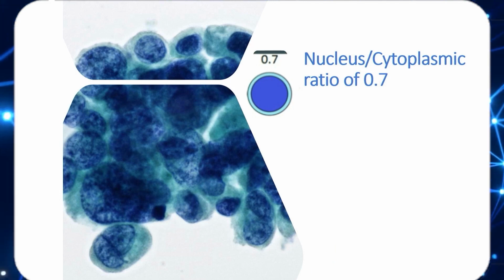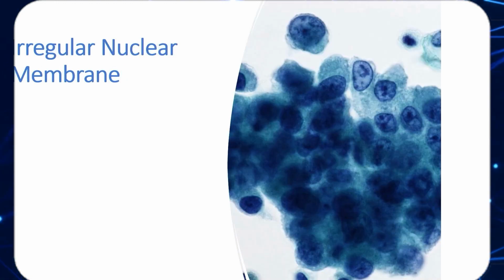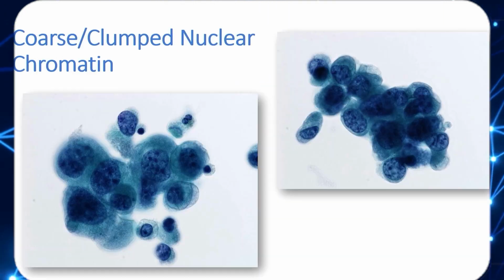Like I said earlier, 70% or higher should be comprising of the nucleus within that cell. This is the intensity you can expect to see to represent hyperchromasia, fairly classic. Again, here the nuclear membrane irregularities are noted. These are not well defined or smooth. You can clearly see them in their various configurations here. But again, outline is very, very irregular.